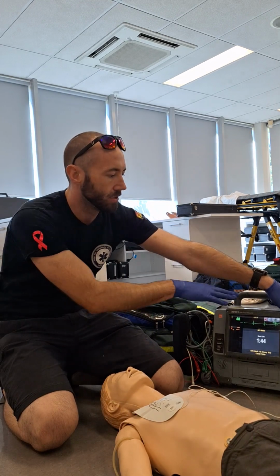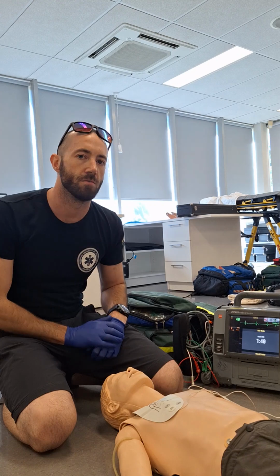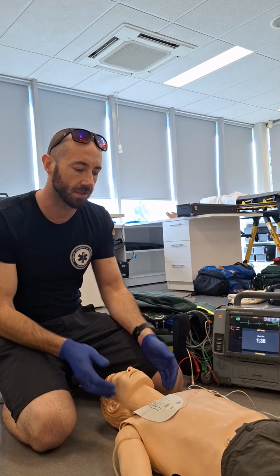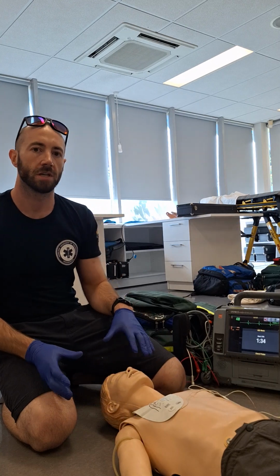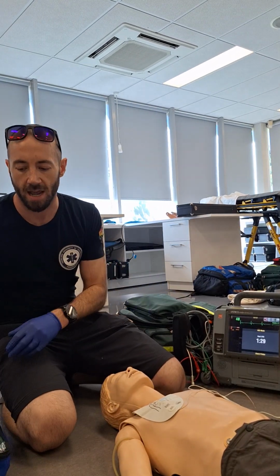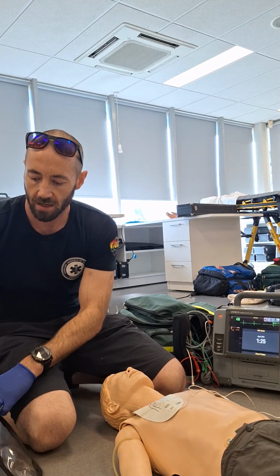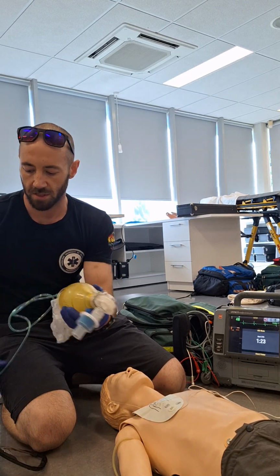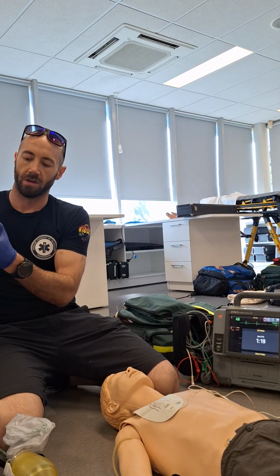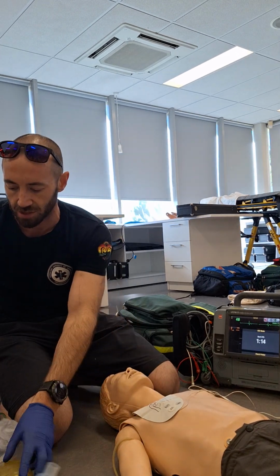Chest, we would go ahead and turn off the metronome, we would update comms and start our own metronome. And now, because of the circumstances of this hypoxic cause, we're going to prioritize getting an LMA in place and as many ventilations as we can happening within this first cycle. So in terms of ordering, the first thing I'm going to do is attach my BVM to the oxygen so it can start filling up with high levels of O2 before we come to do our first ventilations.